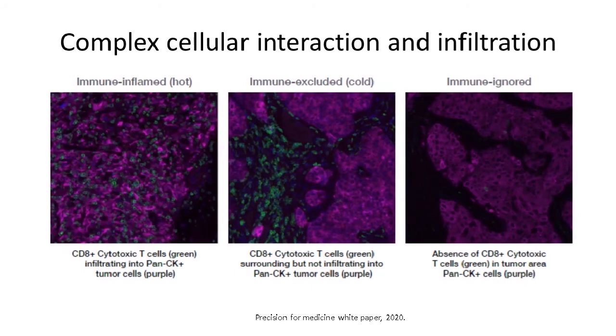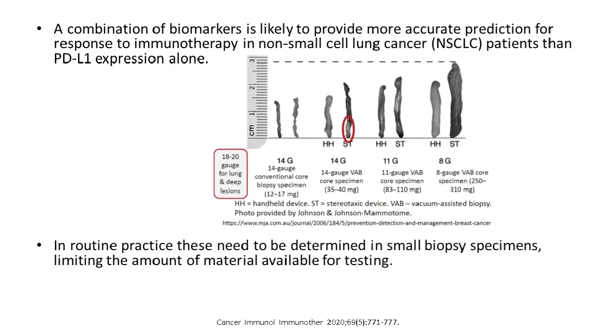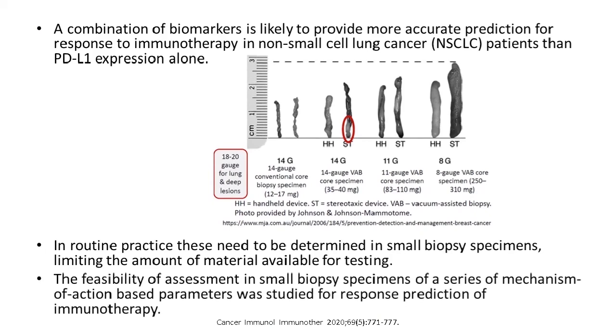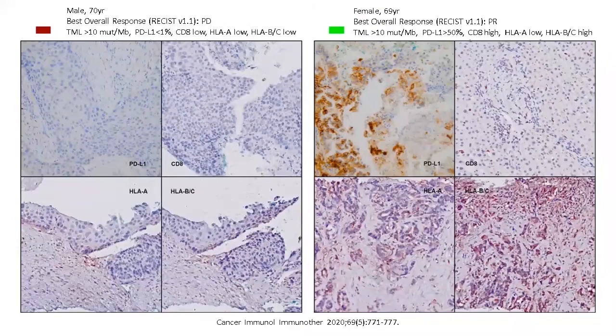So this actually outperforms some of the more classical markers that we know, which are predictive for response to immunotherapy. And by combining all of these, you can actually achieve a very good pooled specificity. So you can do that by looking at all of these components in isolation, for instance, looking at exclusion of CD8 cells, again, by using multiplex techniques.